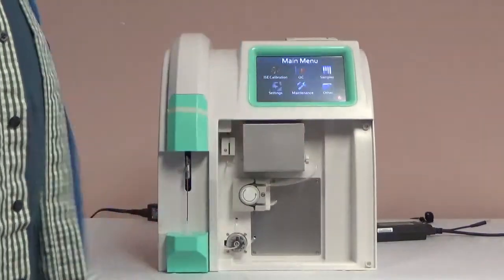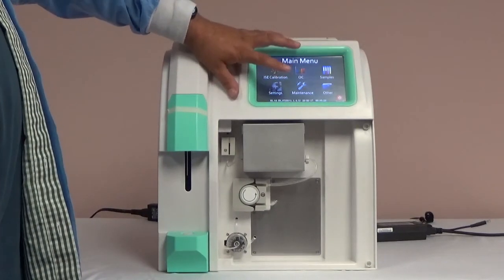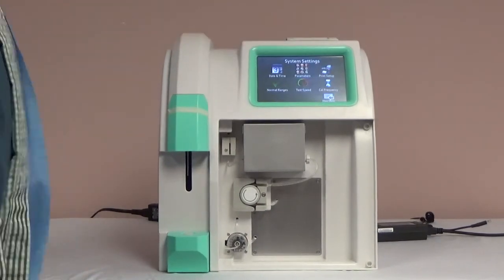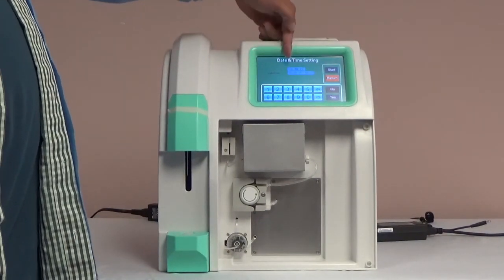After the pack is primed, go back to the main menu to begin adjusting the main settings, starting with the date and time. Click settings, then date and time. Press start and enter the correct date, then time. Press yes, then return.